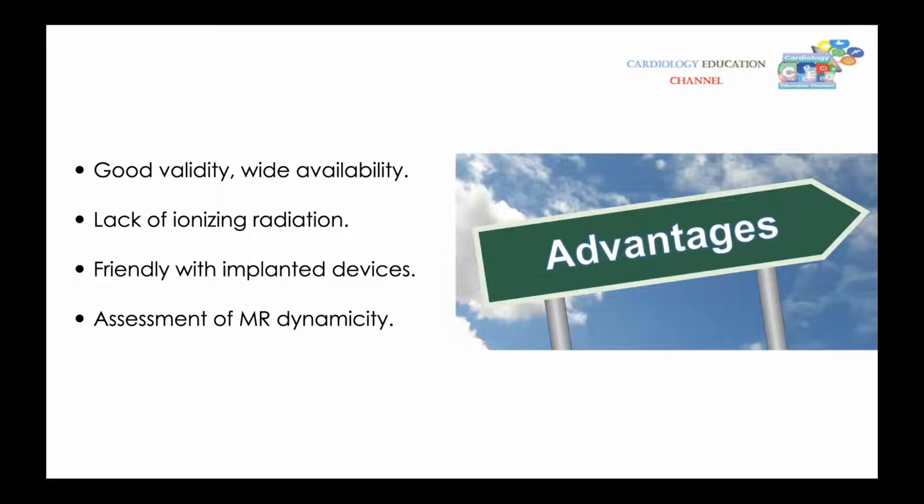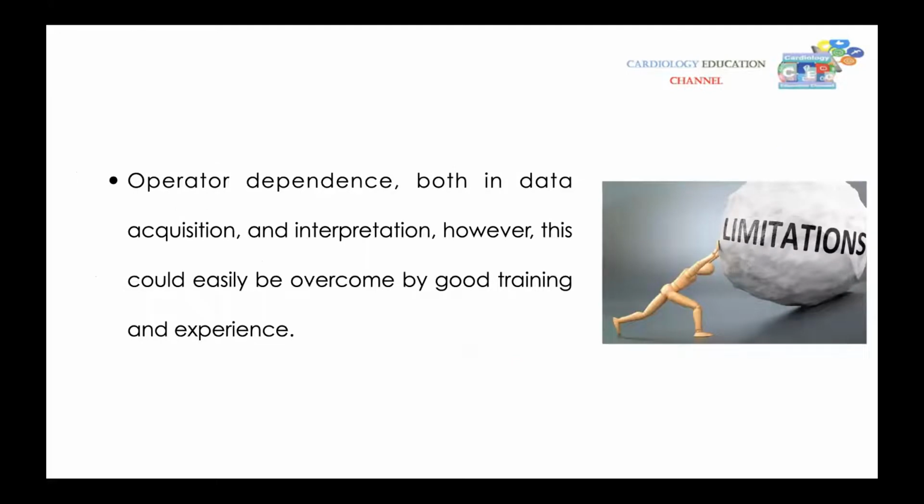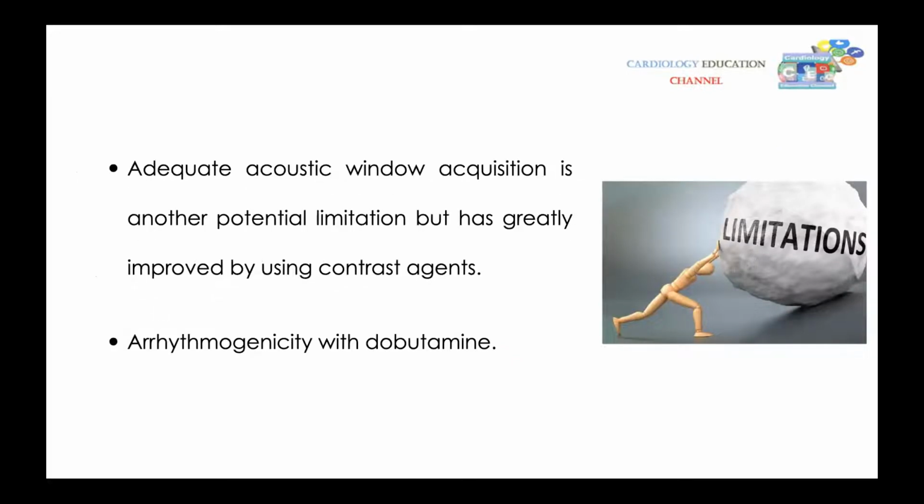As I said before, it requires the presence of an adequate acoustic window. It's a limitation for using this technique, especially if you have female patients, obese patients, or smokers. All of this may hinder visualizing the endocardial border in a clear way. And also the arrhythmogenicity with dobutamine is a concern, but it occurs less with the lower doses of dobutamine.